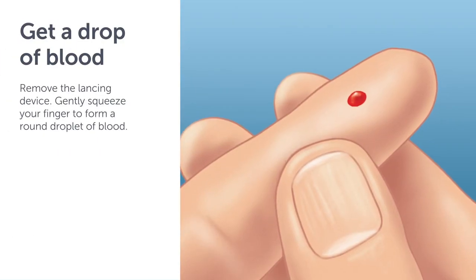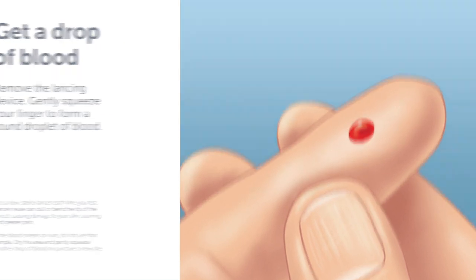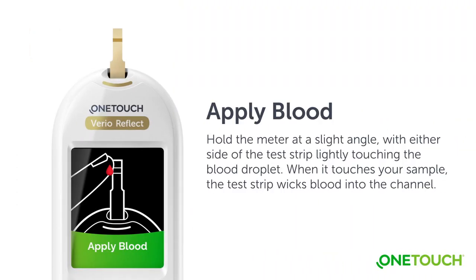Remove the lancing device. Gently squeeze your finger to form a round droplet of blood. Hold the meter at a slight angle, with either side of the test strip lightly touching the blood droplet. When it touches your sample, the test strip wicks blood into the channel.